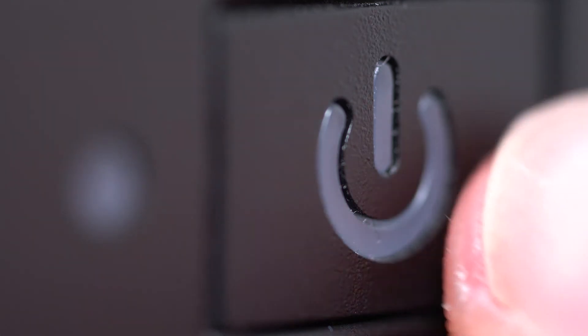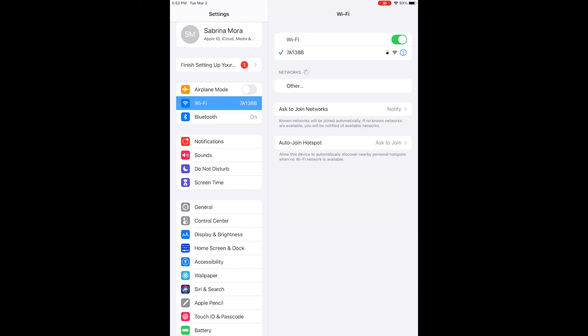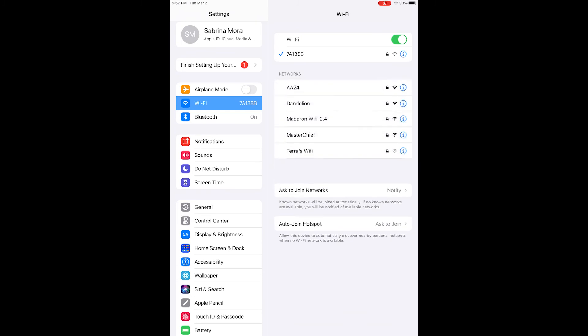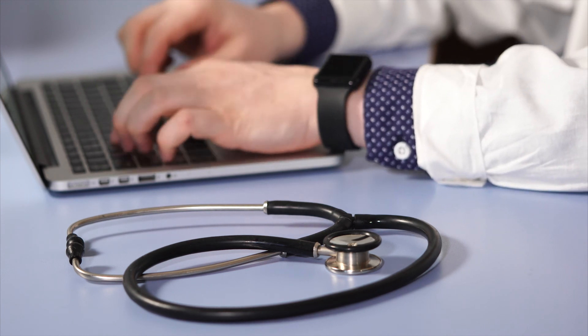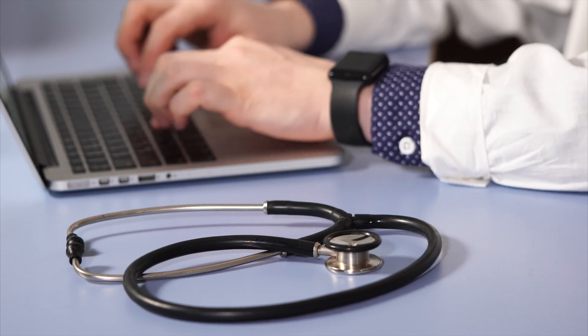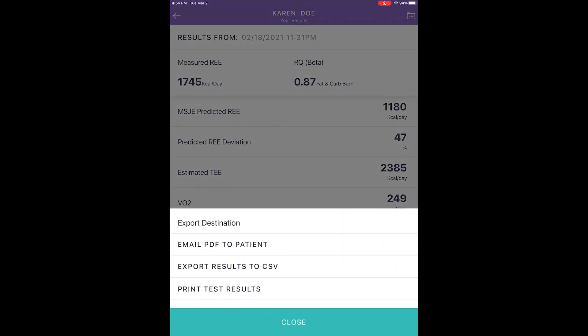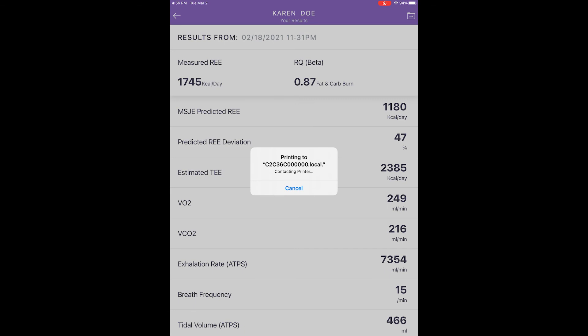A: Make sure your printer is on with the wireless function on. B: In your mobile device, go to Wi-Fi and search for available wireless devices and printers. C: Select the wireless printer to use, enter a password if required, and join the mobile device to the wireless printer. Once the printer is connected, go to the App Results page, select Print Results from the upper right-hand corner, choose the printer, and proceed to print. A page with the printed client-patient profile and measurement results should be obtained.